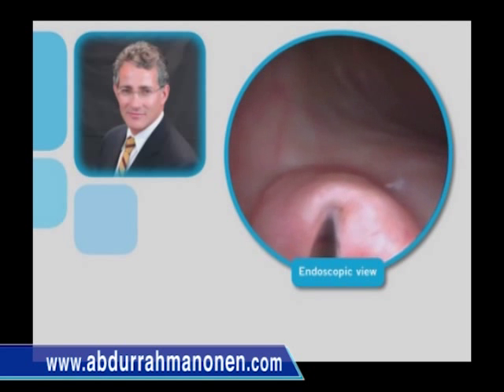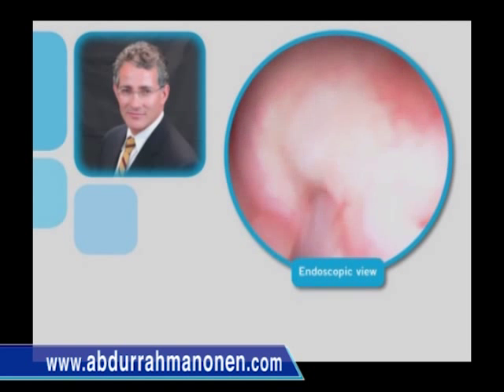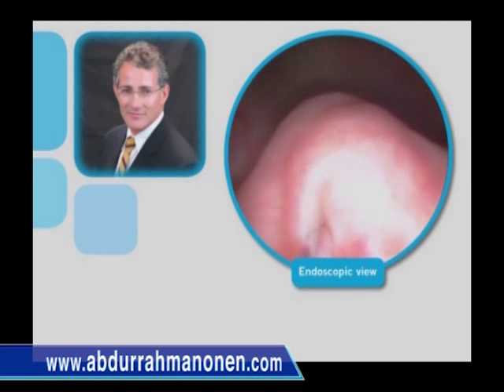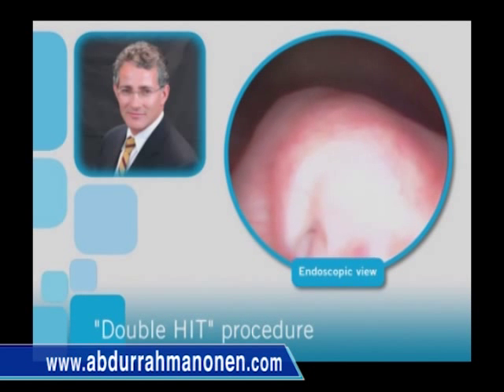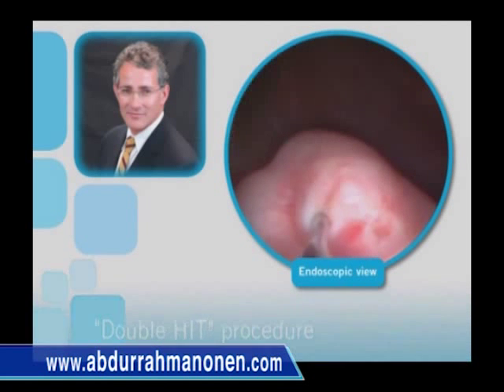After the first proximal injection is performed, the ureteral orifice is then hydrodistended. If it is noted to further hydrodistend, then a distal injection will be performed. These 2 tandem injections are termed the double hit procedure, and have been shown to improve the success of injection for both duplex and single system orifices.